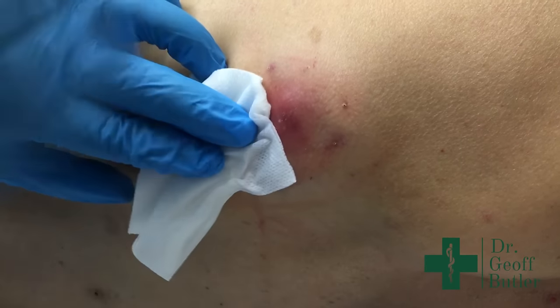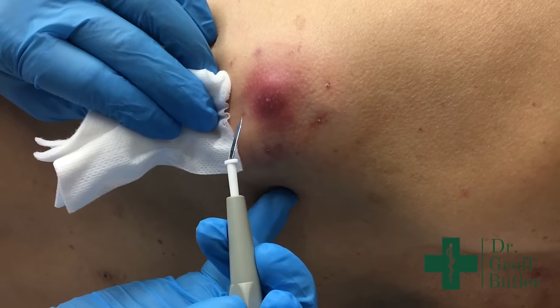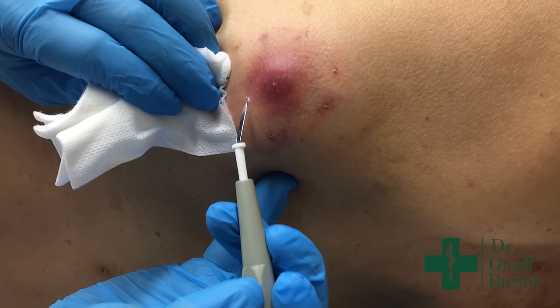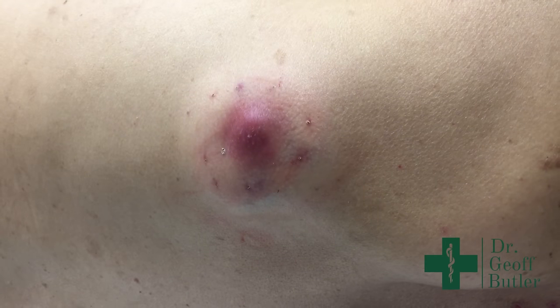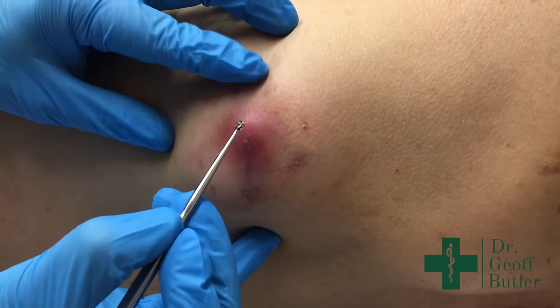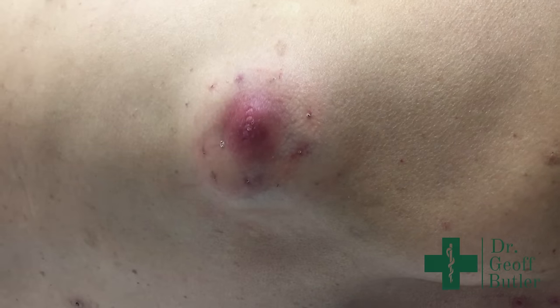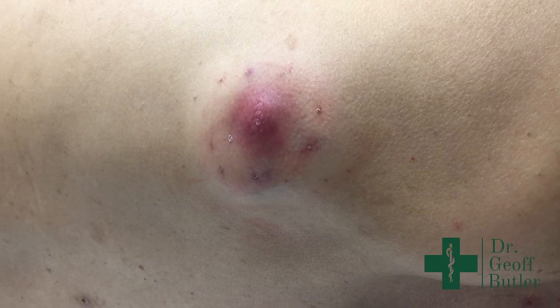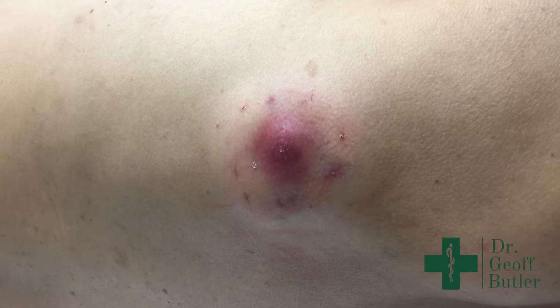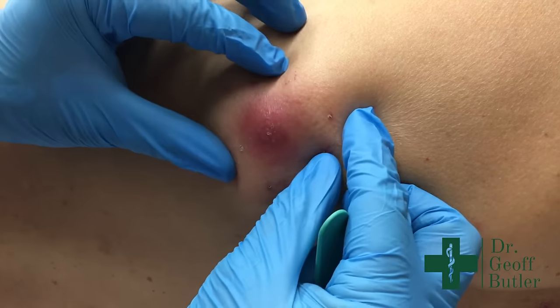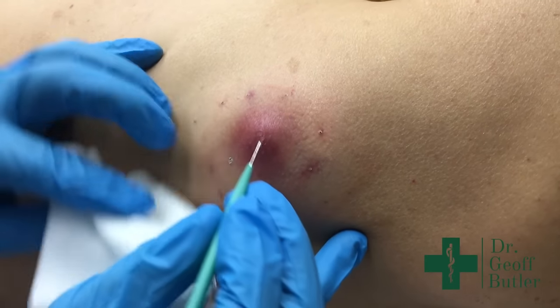A little bit. So again, this is just a hyphricator. I'm going to cauterize that one spot just to try and keep our field as clean as possible for as long as we can. Do you feel that, Tom? Does that hurt? No. No pain there? All right. So in terms of incision lines again, this will be a horizontal incision. And hopefully we can control the mess a little bit. It's going to feel some pressure here, Tom.